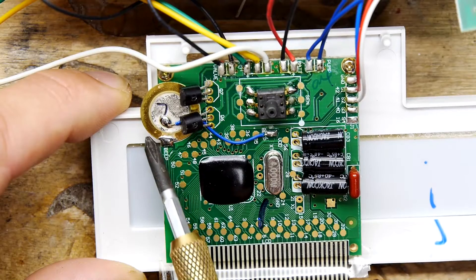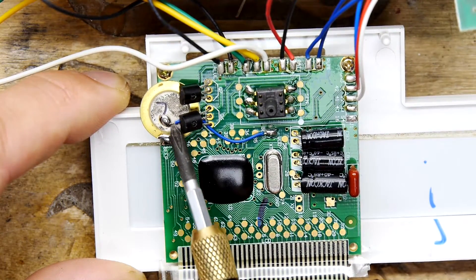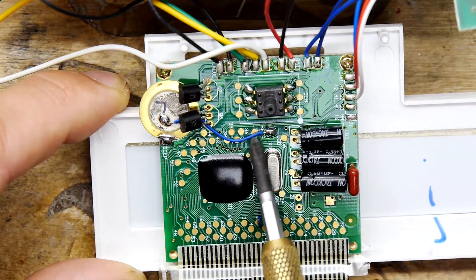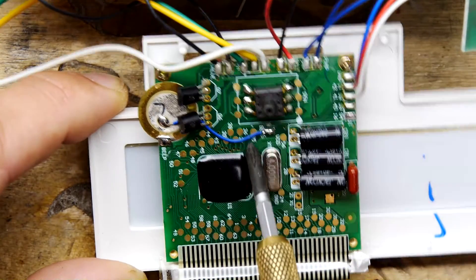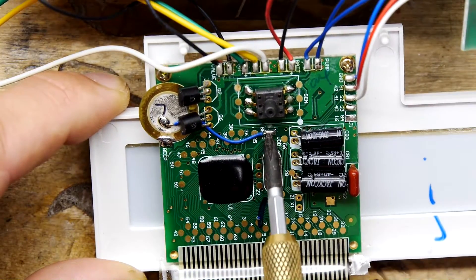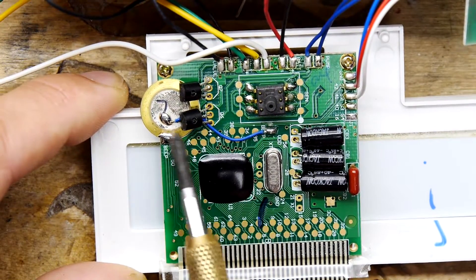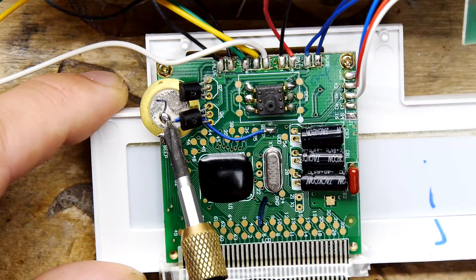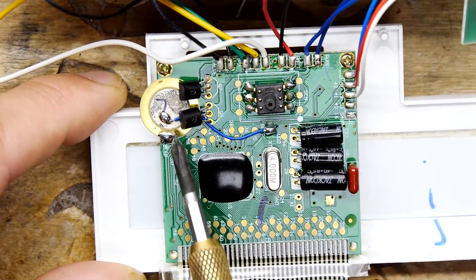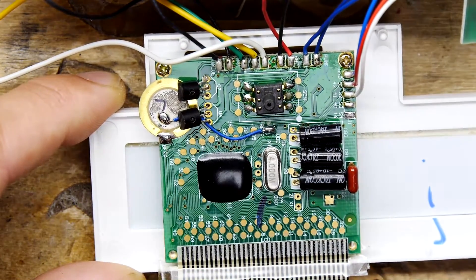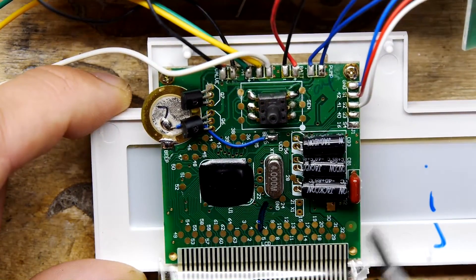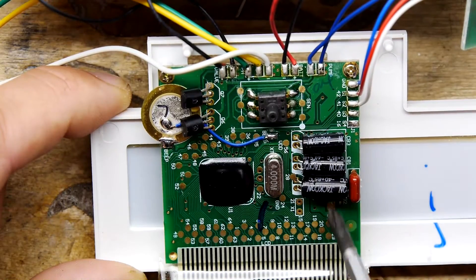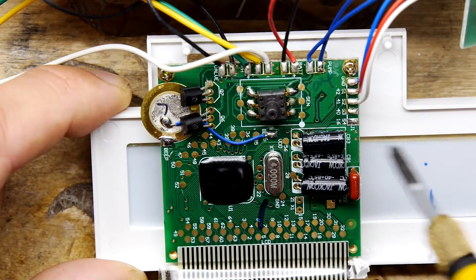Interestingly enough, though, you see this piezo speaker, how it's just sort of splodged on here. You see this wire, this blue wire here goes to a track on the PCB that says beep. So interestingly enough, that's obviously how it's designed to be fitted with that bit of wire. It's not bodge wire. That's just in the design.